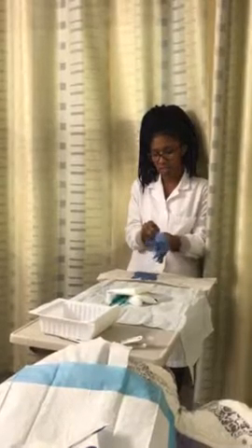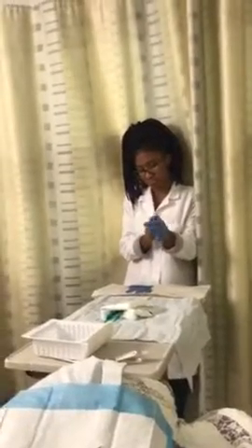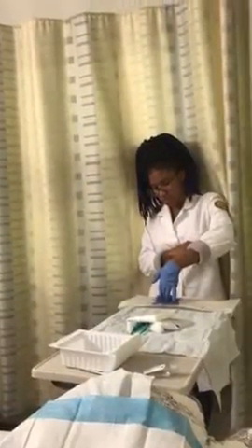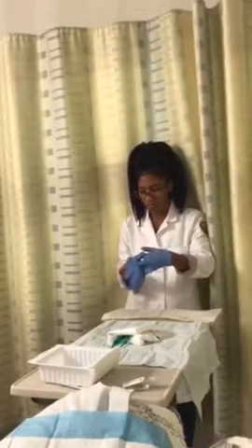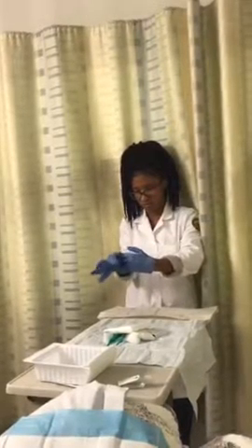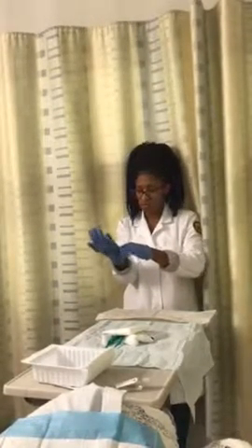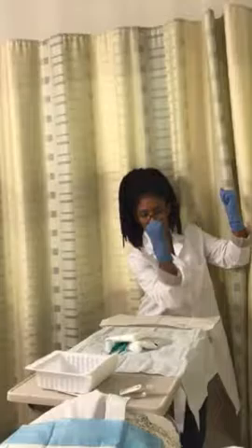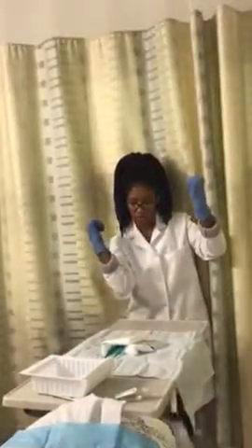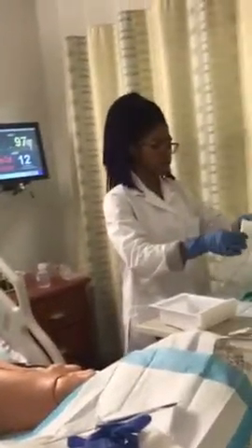I'm going to insert my hand. And now, making sure not to touch the inside part of the glove, I'm going to put on my dominant hand. And I can now fix the cuff of this glove. Okay. I'm now going to set up all of my supplies, make sure that they're ready.